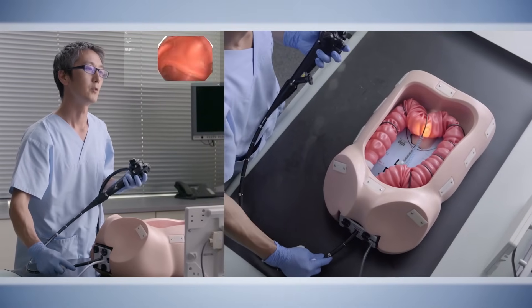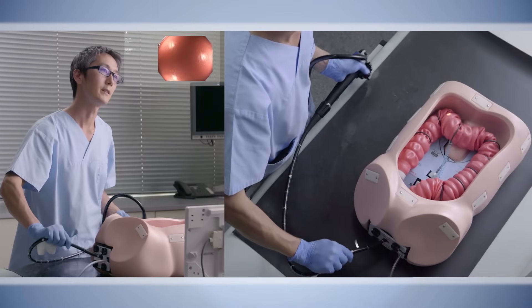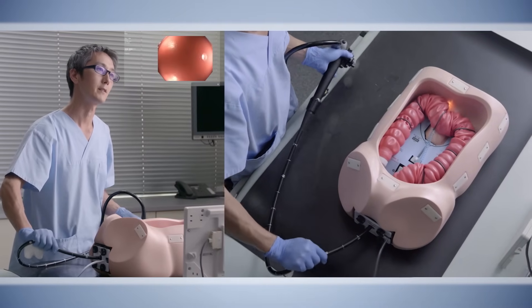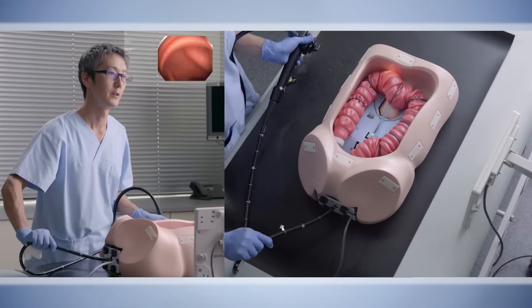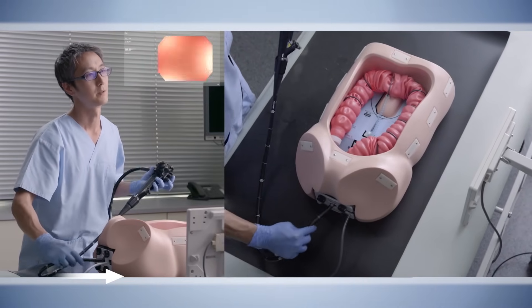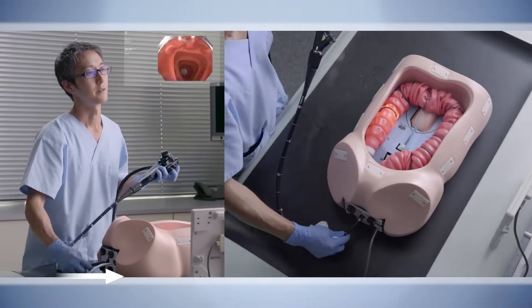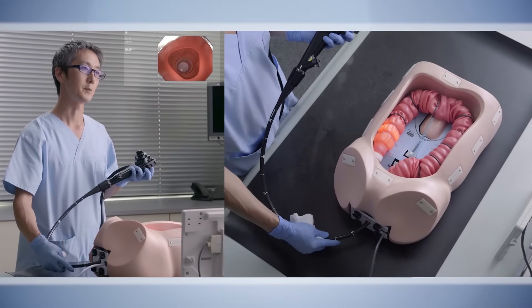The same thing — you want to try to shorten the mobile transverse colon. It's basically a similar technique as when you shorten the sigmoid colon, and you finish the total colonoscopy like this.